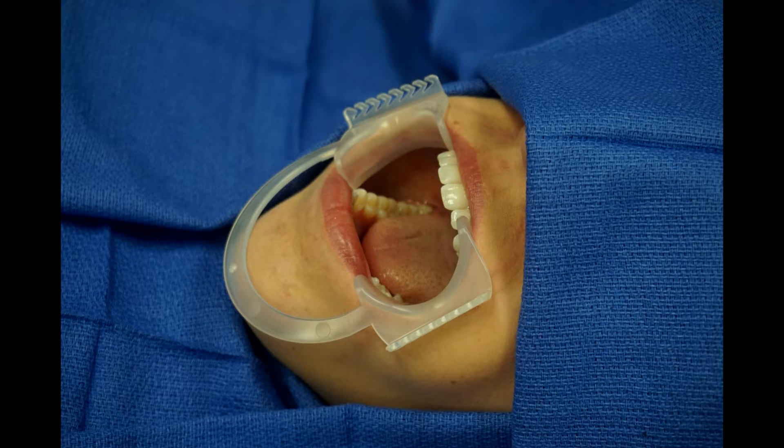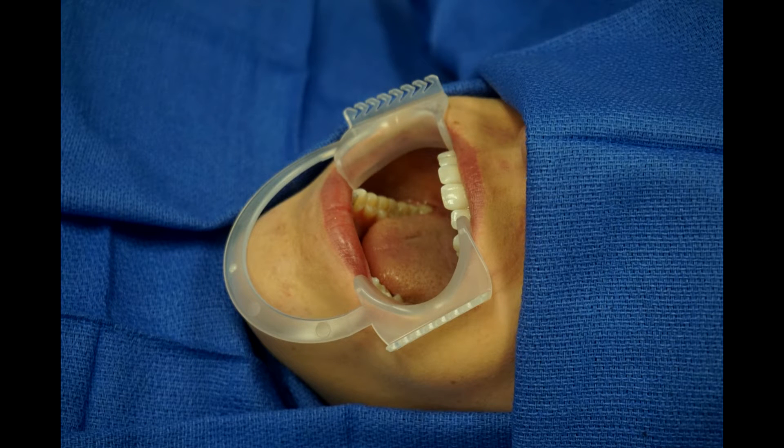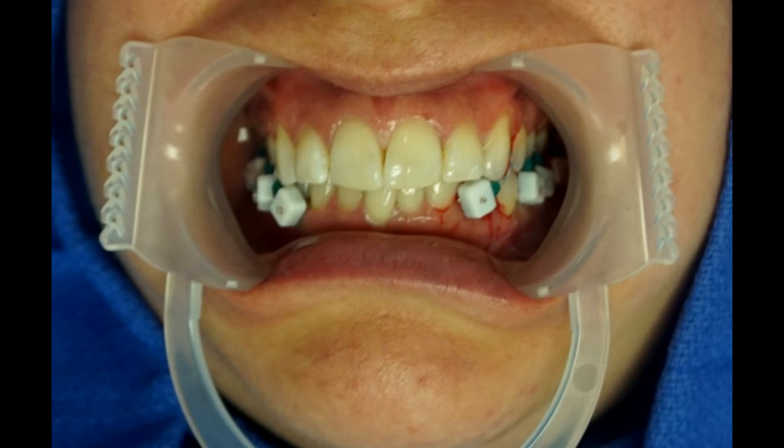A cheek retractor is placed in the mouth as shown. The devices can be interlaced between the teeth as shown in the picture. The end result is maxillomandibular fixation.